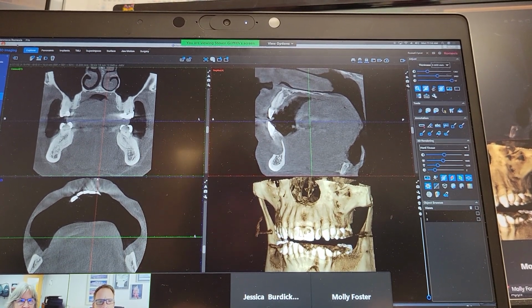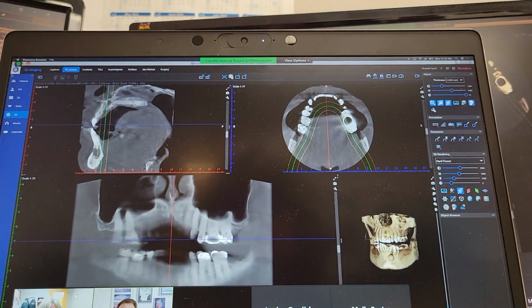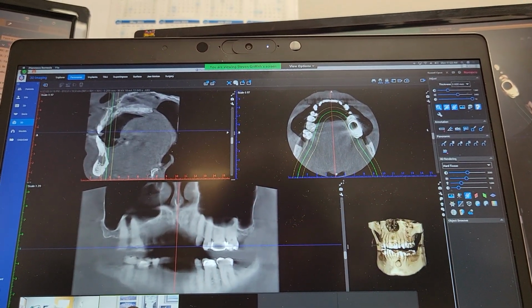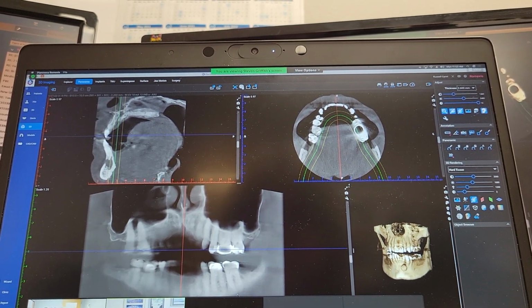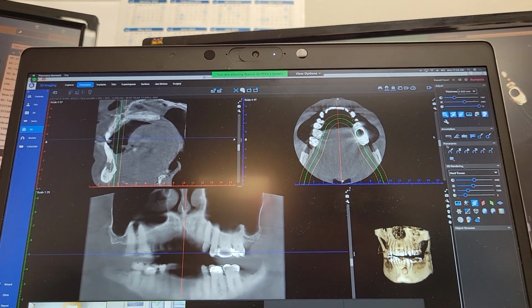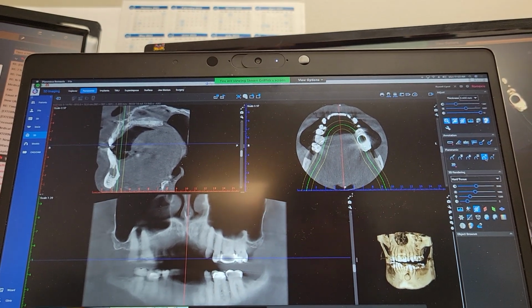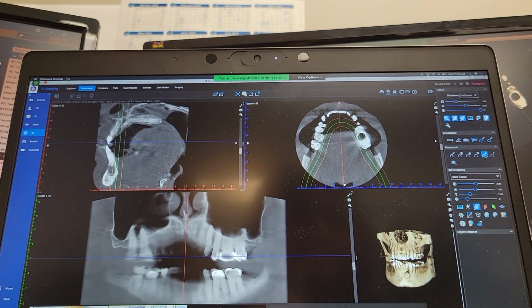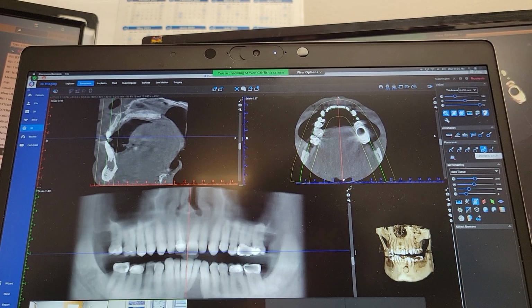Come right up here. Up to the top toolbar next to Explorer, hit Panoramic. Now, when you look at it, you say, well, Griff, that's not a pan. No, it's a horrible one. So if you come over to the right-hand side where it says Panoramic, you have two icons on the end, A and F. These are two different algorithms. I always hit F or A first just to see what it says. Not too bad.